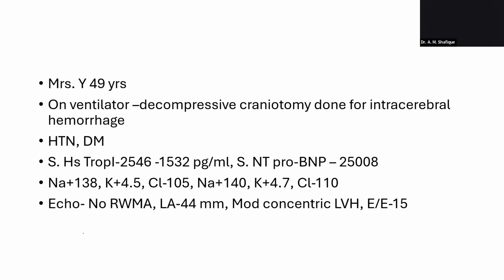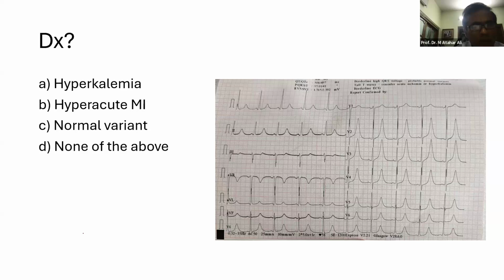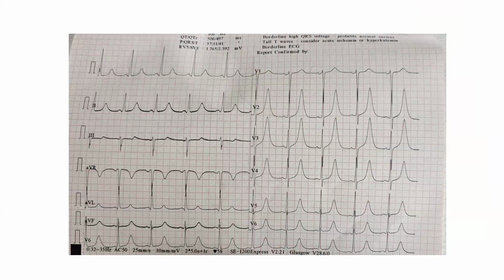So then what would be the diagnosis actually? It is not in favor of acute myocardial infarction, and definitely the potassium level is normal. Then it is a point of discussion. So back to your ECG again, please. Usually cerebral T means deep T inversion. Here it is hyperacute like T waves, very prominent T waves. But could it be a variation of adrenergic toxicity because of the stress the patient has undergone for craniotomy?